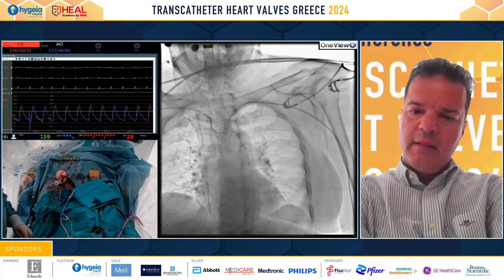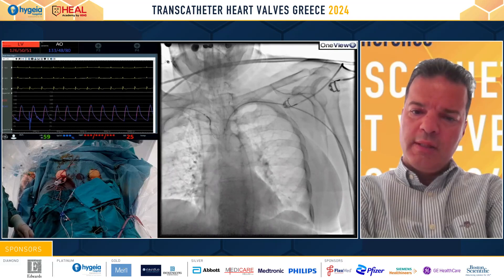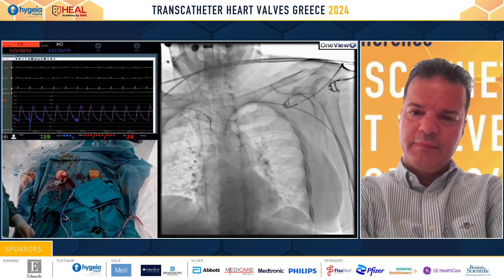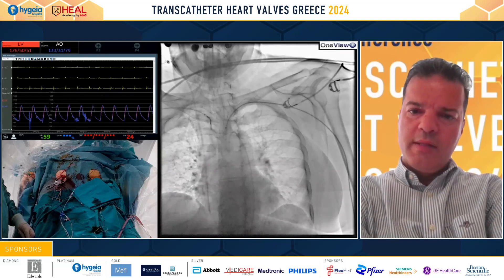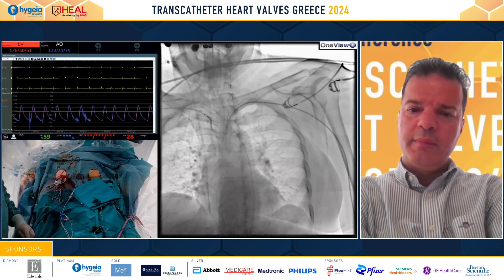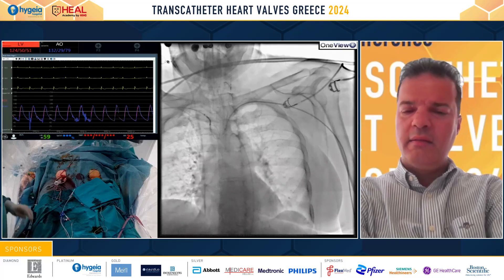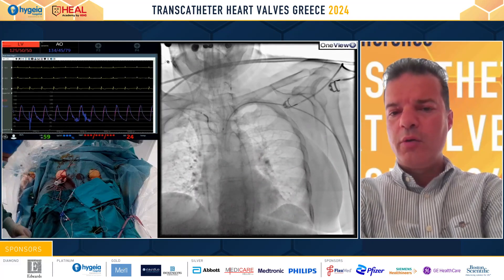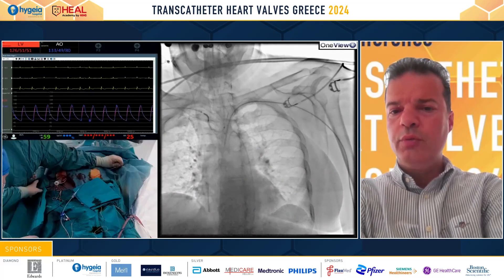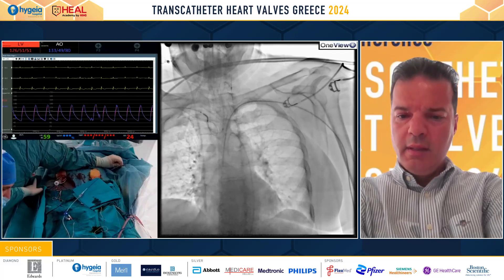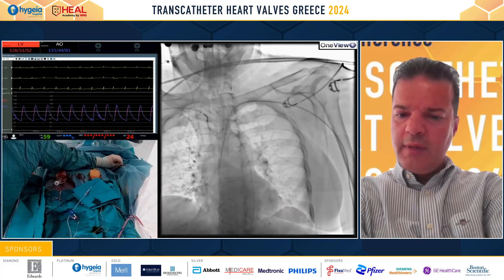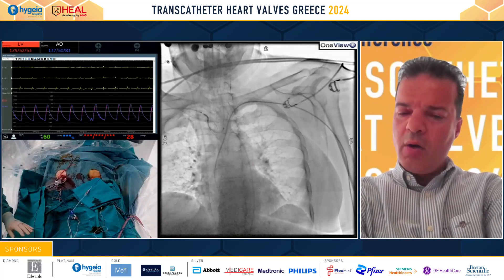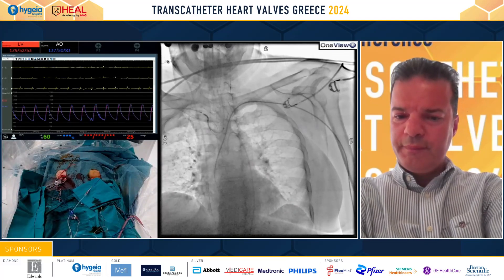You can see the wire going up as we pull the system and then push the distal basket. Once the Sentinel is secured in place, the next step will be to take our aortic root view by advancing the pigtail to the aortic root.